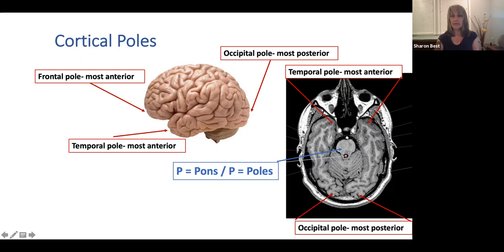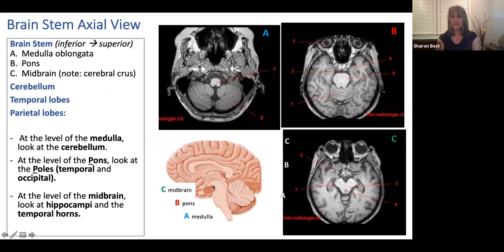To review the brainstem: we have the medulla, pons, and midbrain. At the level of the medulla, we're only looking at cerebellum. As we scroll superiorly, we'll see the pons come in and eventually take its characteristic shape — remember P for pons and P for poles, giving us a right and left temporal pole, a right temporal lobe, left temporal lobe, occipital lobe in the posterior aspect, and some of the cerebellum.